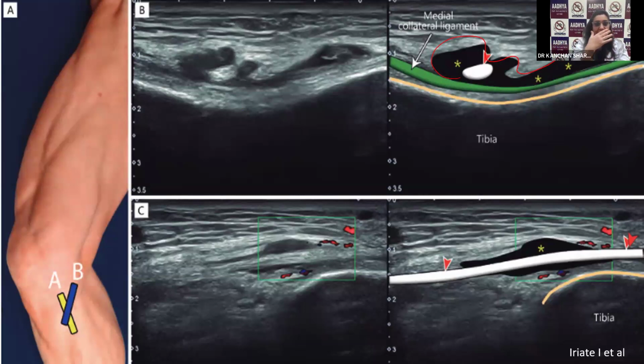So if there is a patient who is coming to you with this kind of pain over the medial aspect of the knee, over the tibia, okay? You put your probe, and when you happen to see something like this, this is nothing but pes anserine bursitis. Then you need to go for a local with steroid. That's all. Patient will be pain-free, okay? So that's all for the pathology.